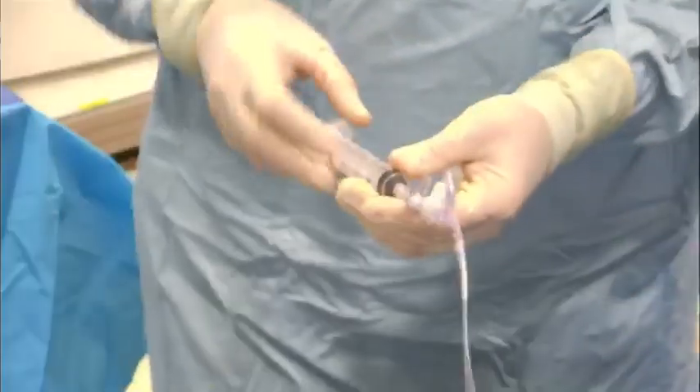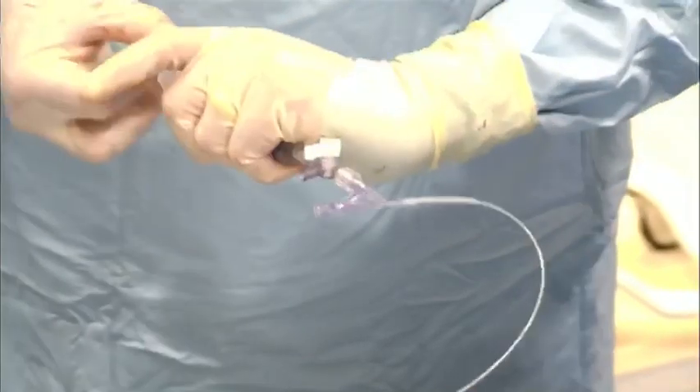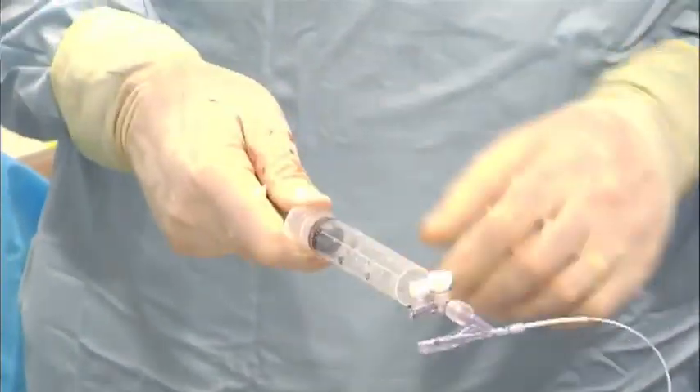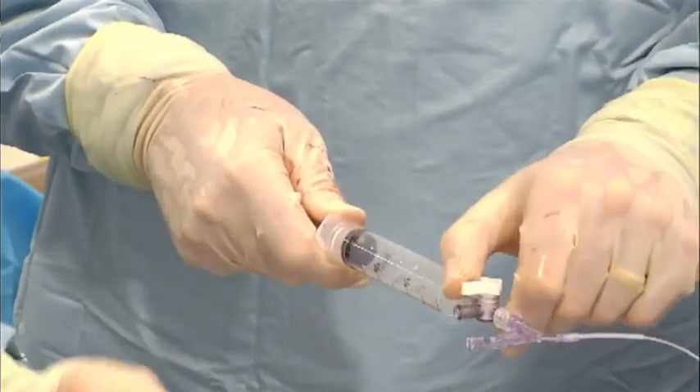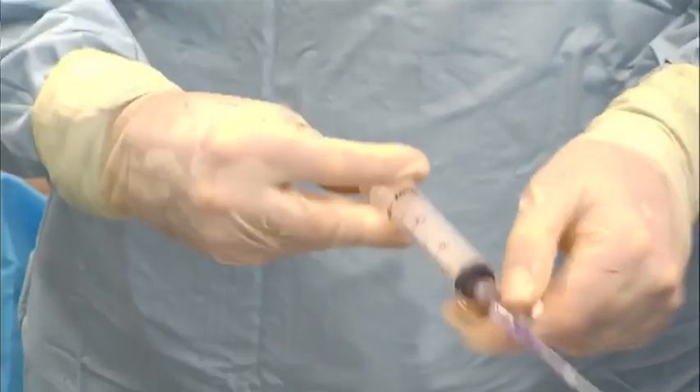So I'm going to show the prep, and then you go back to that. Brand new fresh stopcock, brand new syringe. You're going to go full pull. I try to wait just a little bit, but you want to make sure they're dry. No air, no chance of air getting in. We're going to get two of these.